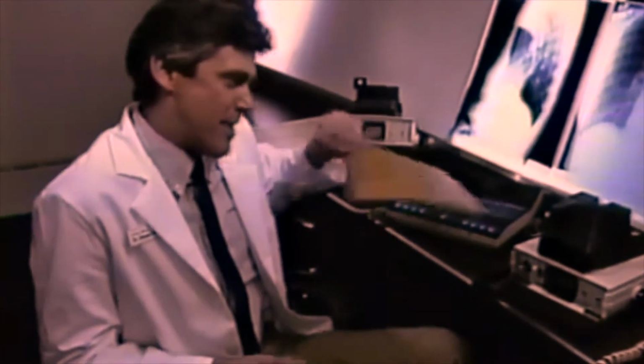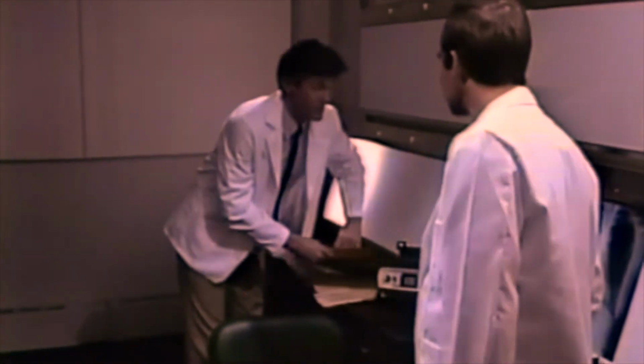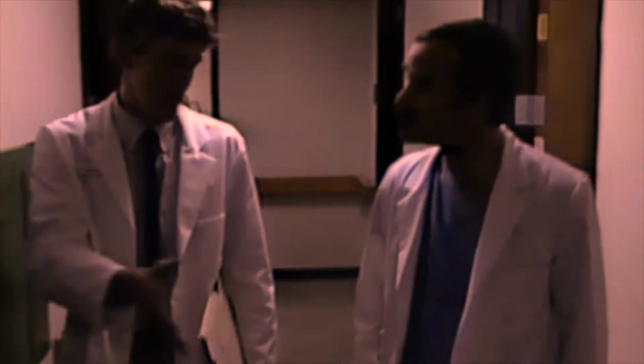No, the nice thing about these is that we can take them down to the ICU. Oh, and maybe we should follow up on your man in a day or two and see how the graft looks. Hey, that's a good idea. Glad I thought of it. And we don't have to disconnect sick patients from respirators and tubes and wheel them down here, so there's less discomfort for all of us. We can get more patients done in less time if we take the unit to them.